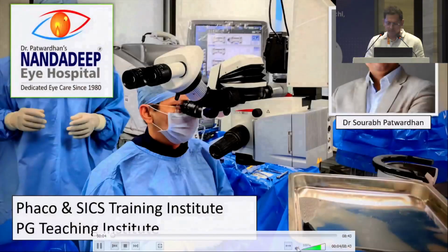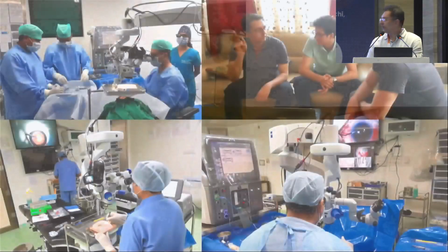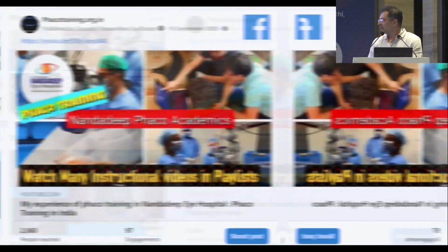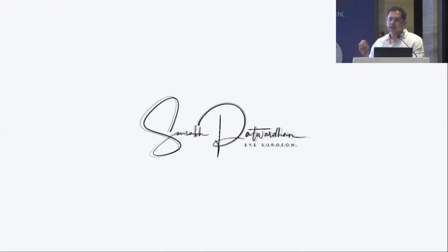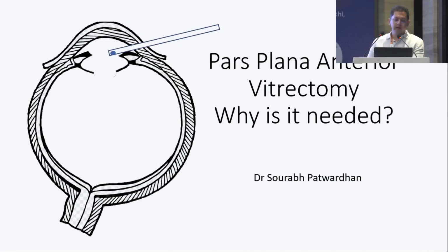As Dr. Deepak has nicely shown, even approaching the anterior vitrectomy through the limbal route can do most of the things correctly, so we rarely need to go pars plana otherwise. But there are certain special situations where it may be helpful. Of course, some surgeons advocate it for all anterior vitrectomy cases.